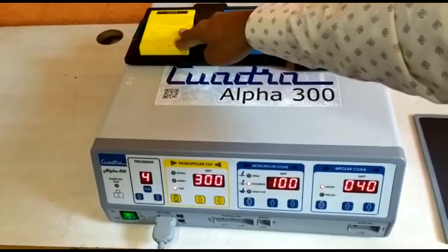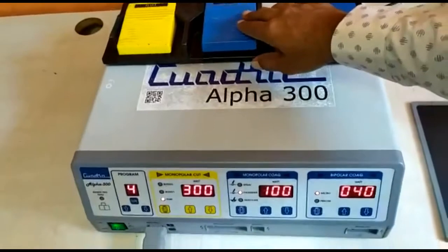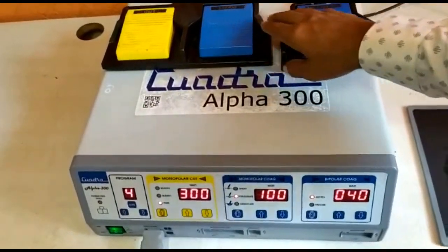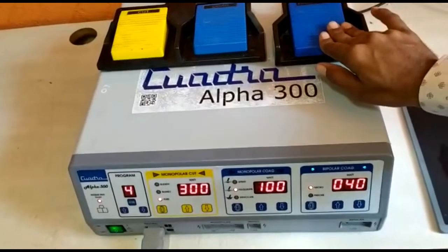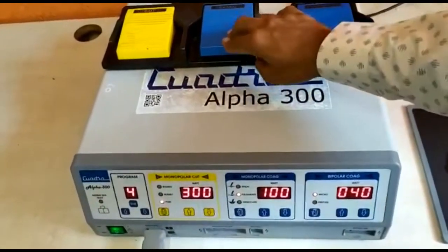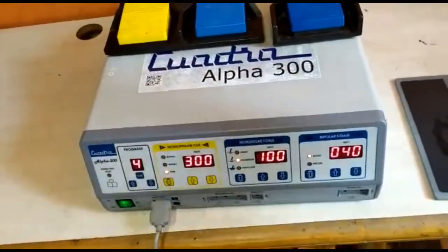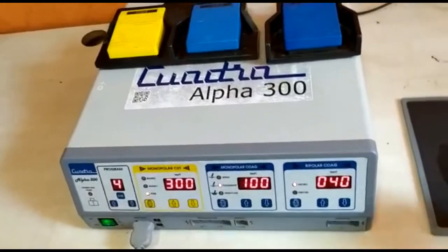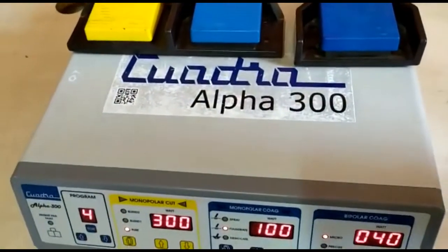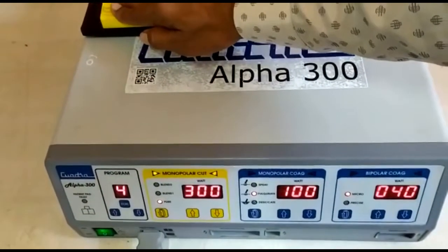If there is not enough contact between the patient and the patient plate, you will hear an alarm sound upon monopolar activation, either through the footswitch or through the hand pencil. For bipolar, the patient plate is not required and it can be activated even if there is no patient plate connected or if there is insufficient contact. Once the contact between the patient and the patient plate is sufficient, power activation is possible.